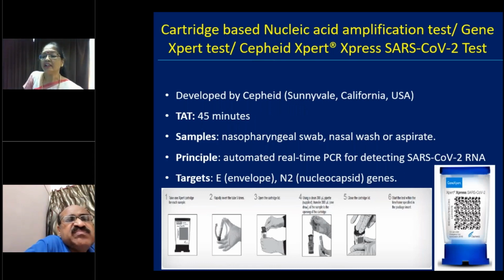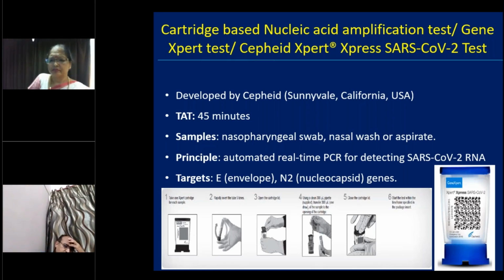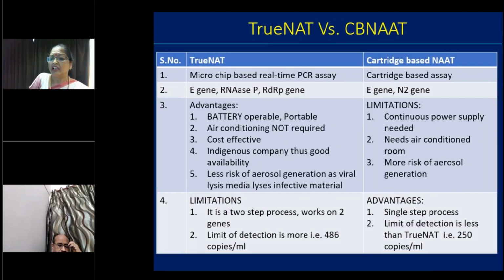Okay, sir. So this was about the basic test. Now there are certain point of care tests, right? Point of care tests means this can be done at the patient's bedside. So there are a few, like this one, the Cepheid one. It takes around 40 to 45 minutes. The principle is also the same, and they have different targets.